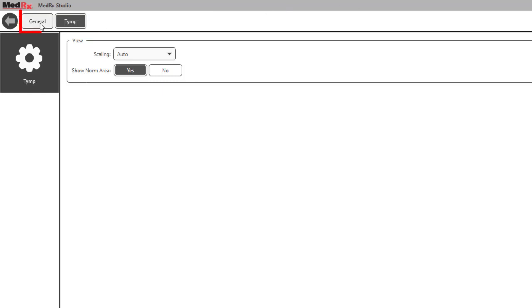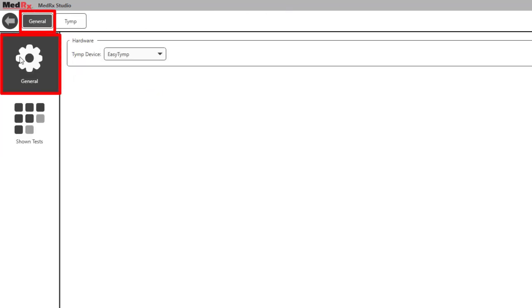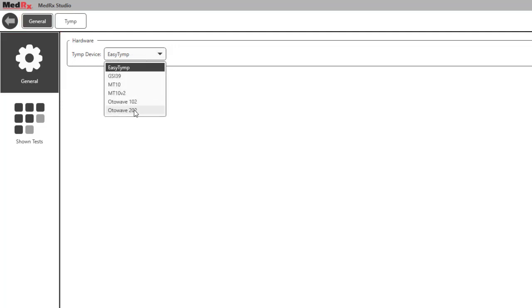General. The General tab allows you to select which tymp device is being connected.